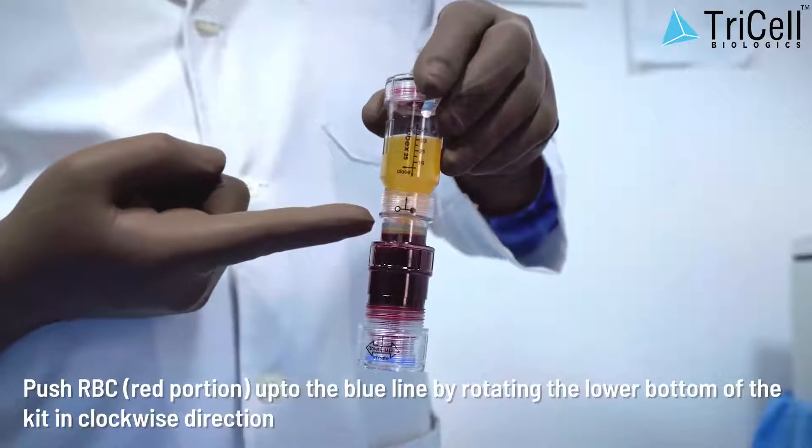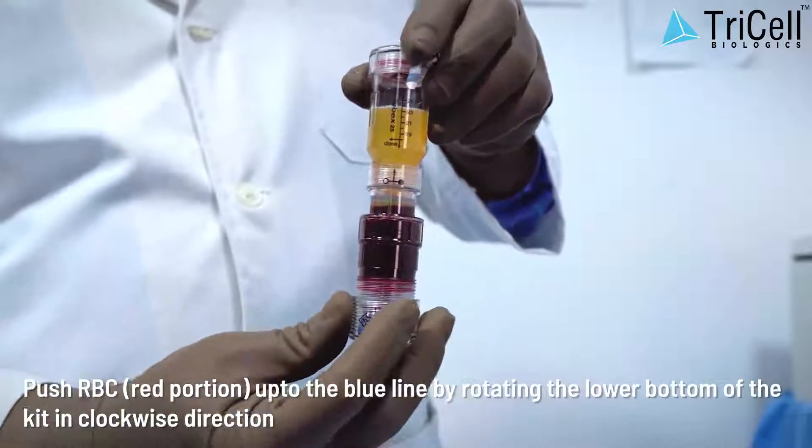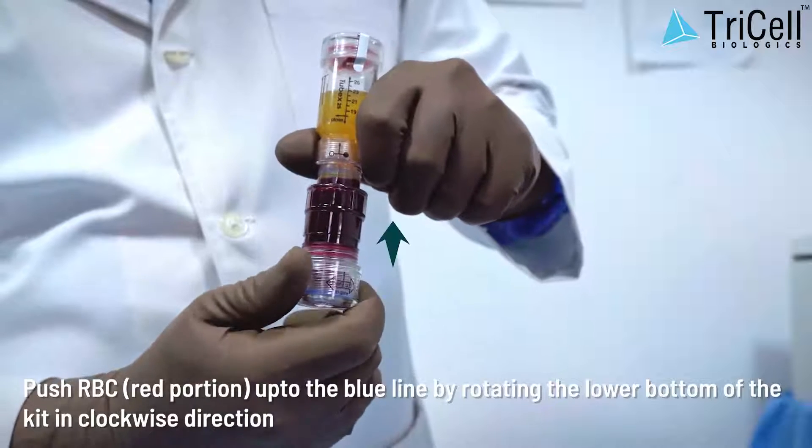Step 6: Push the RBC red portion up to the blue line by rotating the lower bottom of the kit in a clockwise direction.